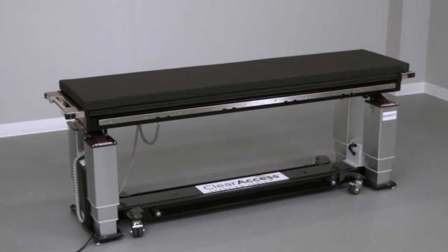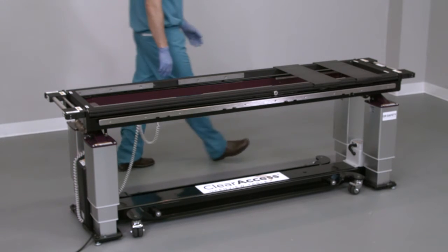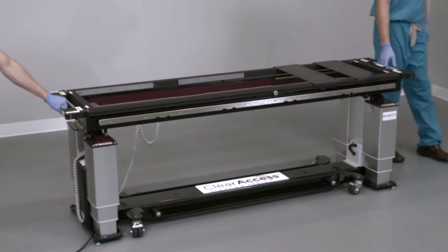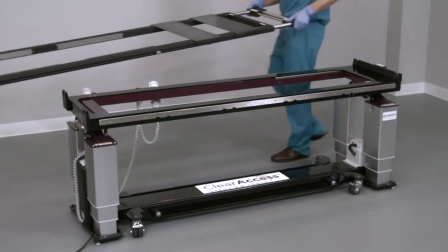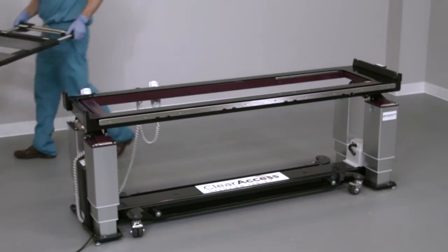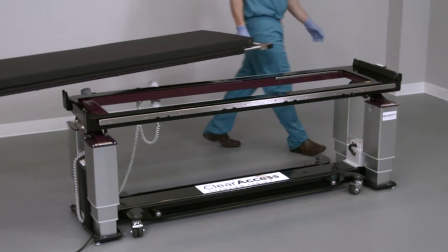If the supine platform is not already installed, the prone platform (open top) may be in place. If so, remove the prone platform with the help of another team member by grasping the silver handles at both ends of the table. Extend the handles by pulling outward, then lift and remove the prone platform from the Clear Access Table base. Next, install the supine platform (flat top) onto the table.